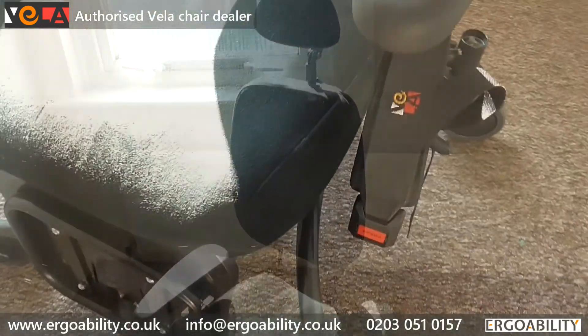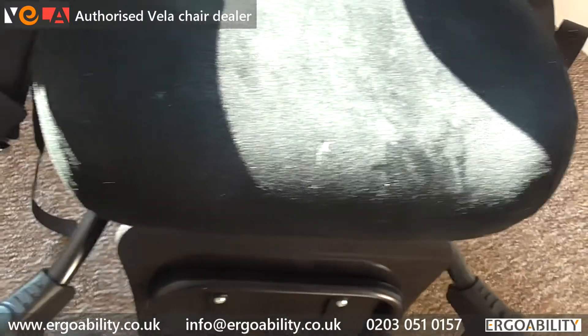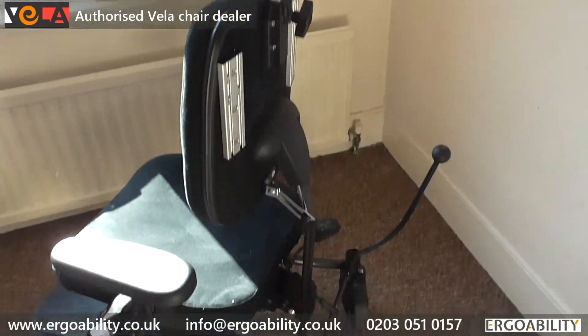We recommend your Vila Tango undergoes an annual service to find, for example, defective or worn parts or poorly tightened bolts.